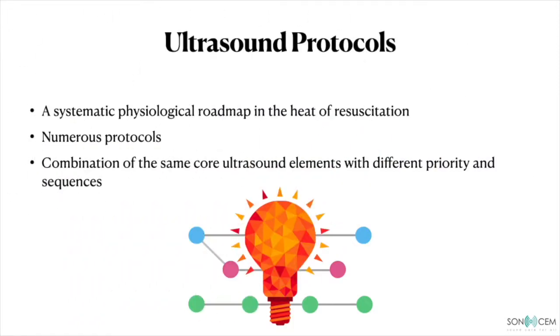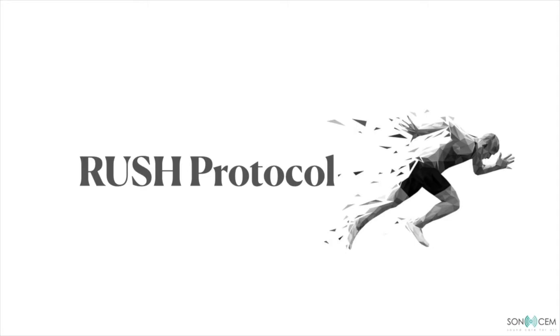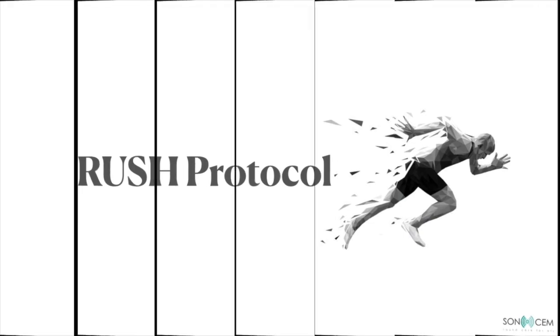So what is an ultrasound protocol? It is actually a systematic physiological roadmap ultrasound that allows us to conduct the PoCUS in a systematic way, hence preventing us from missing any major pathology in the heat of resuscitation. There are numerous protocols, most of them combine the same core ultrasound elements, however with different priorities and also sequences. So one of the most common ultrasound protocols used is the RUSH protocol.